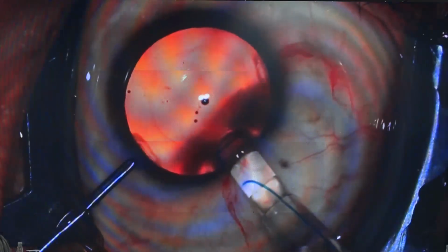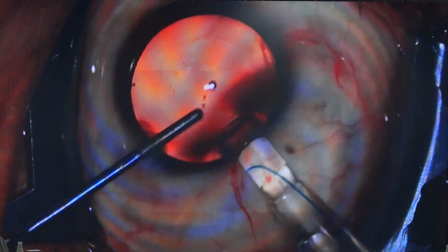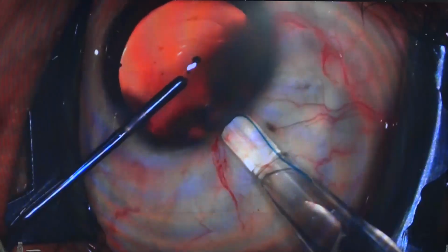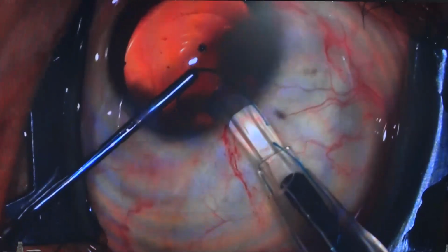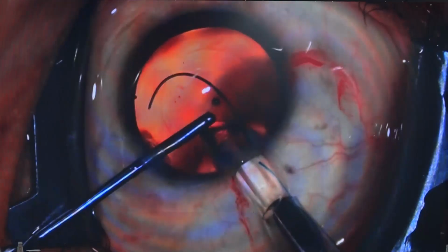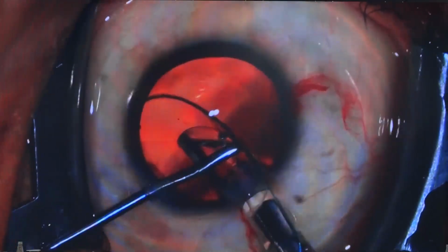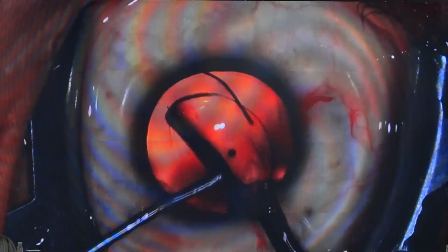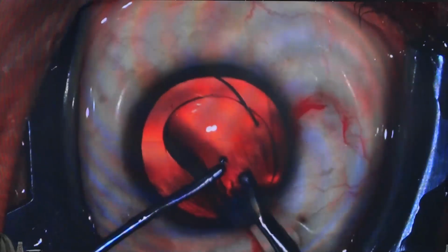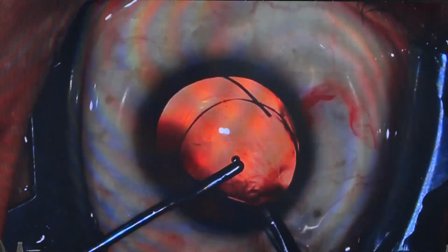We are all used to implanting single-piece lenses. Here, the configuration of the haptics is a little intimidating. So the basic rule that I follow is, first supinate your hand while you are inserting the lens, and once the optic is in, then pronate it so that the orientation of the haptics comes out very predictably.